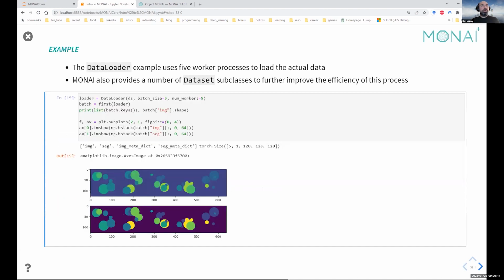And there we go. We've got a batch size of 5. So we've got 5 images. We're running the pipeline that we defined earlier, and we've got our 5 images out, and the workers worked on each of that batch simultaneously.